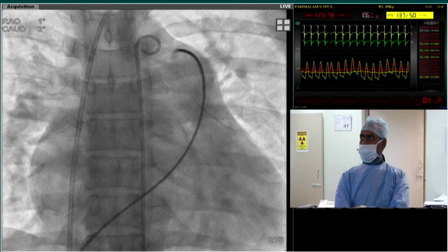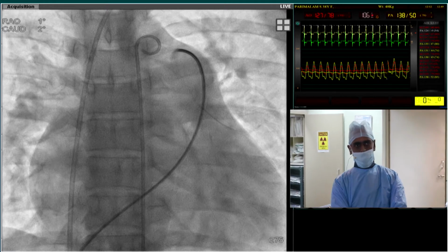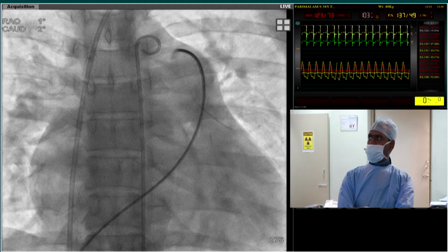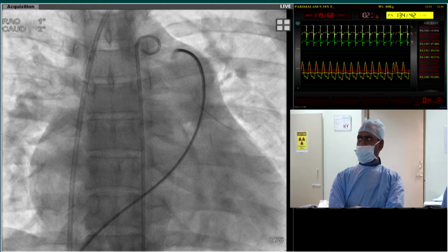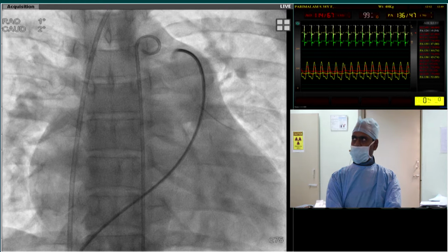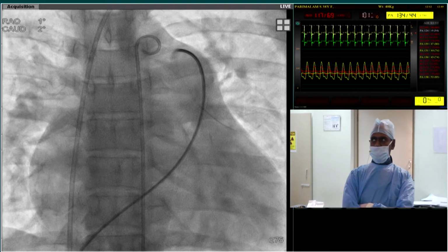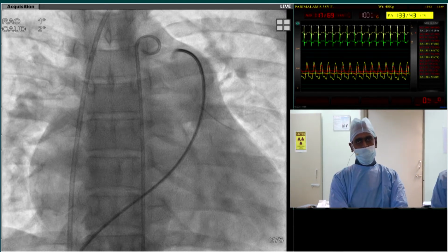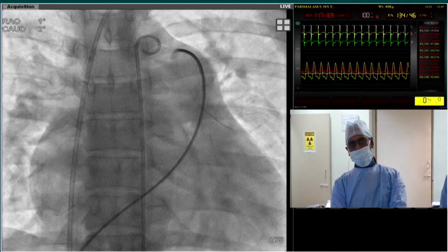On nitric oxide, now we have catheters in the pulmonary artery and descending thoracic aorta. The pulmonary artery pressure is 133 by 46 with a mean of 76 millimeters of mercury, and the aortic pressure is 115 by 64 with a mean of 80 millimeters of mercury. So obviously there is no significant fall on the pulmonary artery pressures on nitric oxide. So she has no vasodilator response.